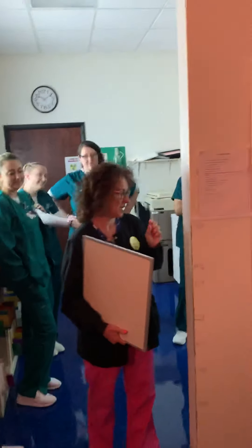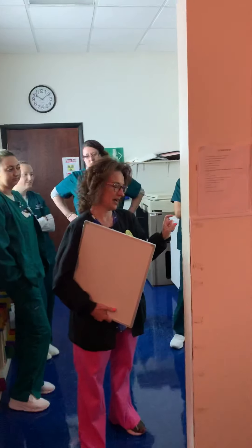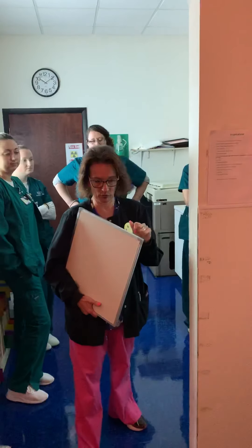I'm going to do a two-view tib-fib. The control panel is set at 70 kVp at 2.1 mAs.